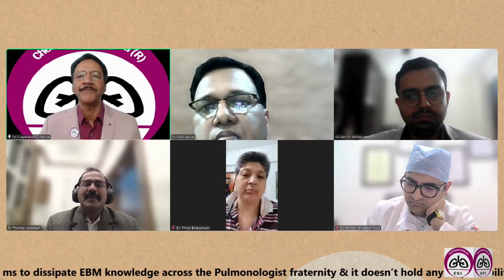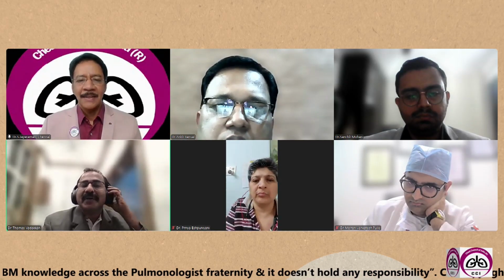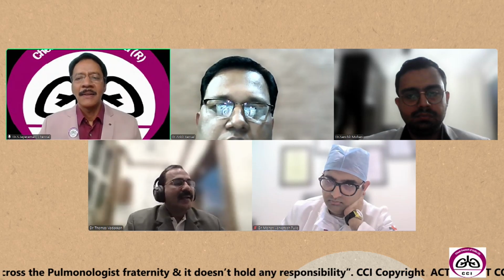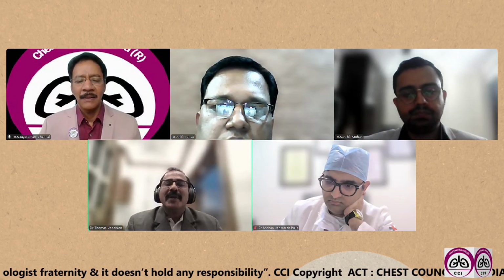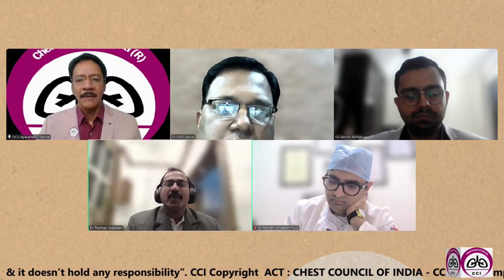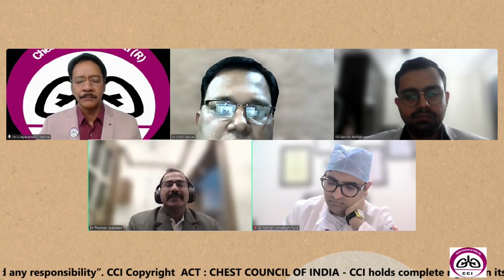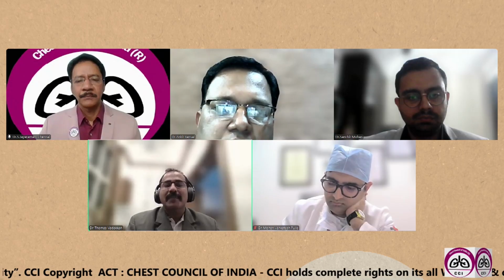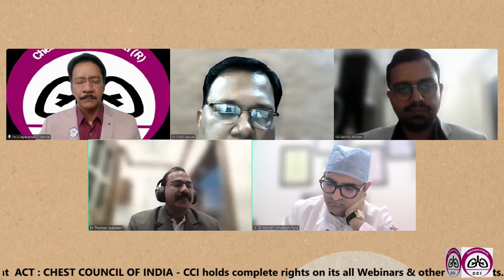Thank you, CCI, for the opportunity. The main limitation of EBUS guided biopsy is the limited tissue, because nowadays we need more tissue for biomarkers, IHC, and NGS. This is often requested by our oncology colleagues, so that's a must. Many times they need more tissue for the completion of the workup.